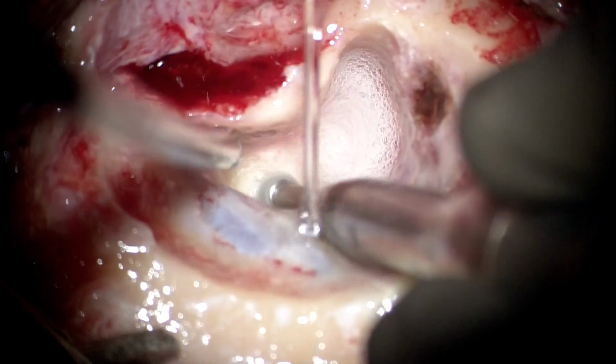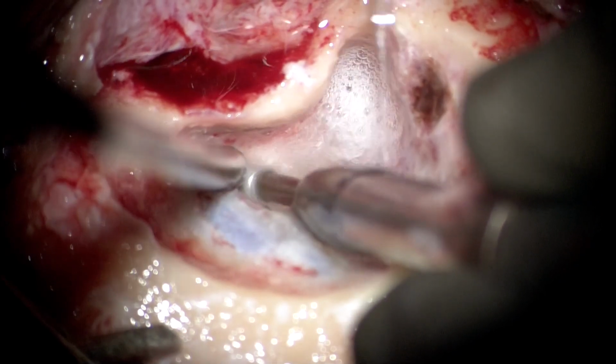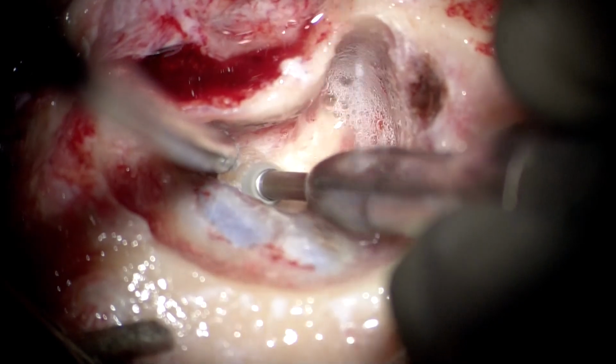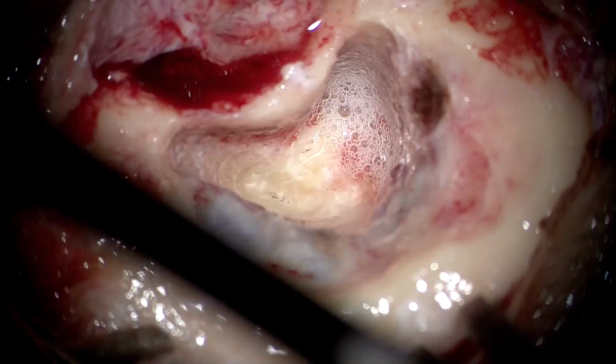Even with the slightest amount of exposure of the nerve sheath, one has to stop and make that the limit of anterior and inferior drilling. You can see now that the posterior canal also has been just partially opened here.